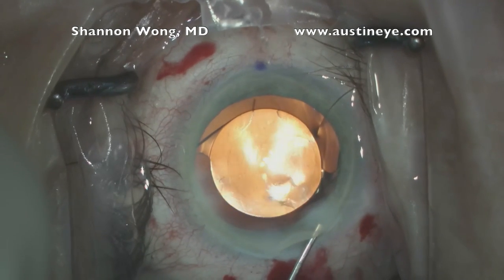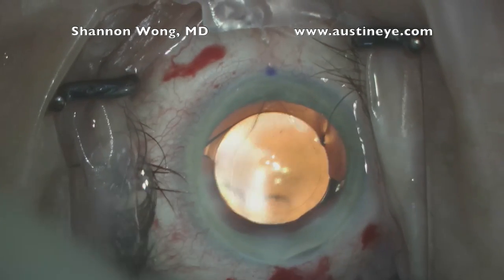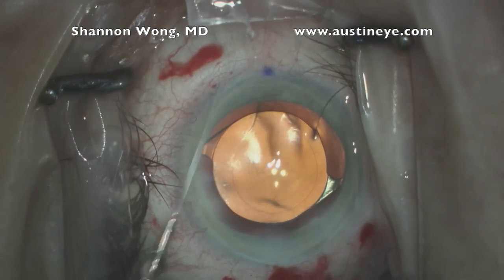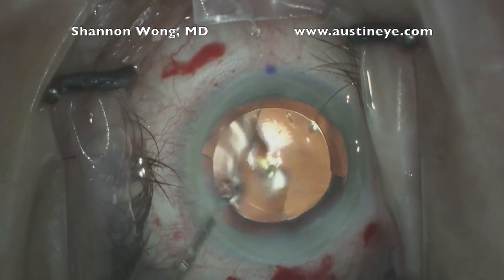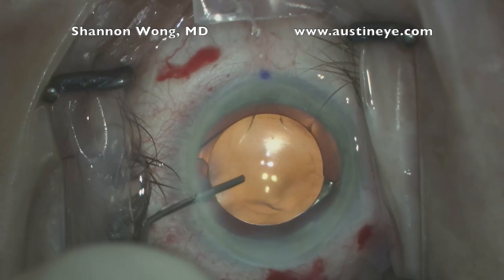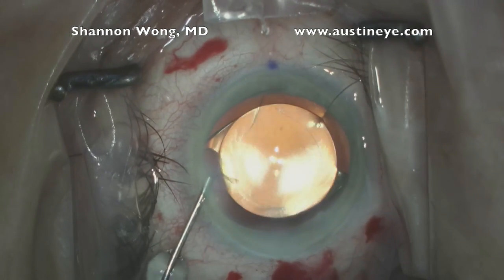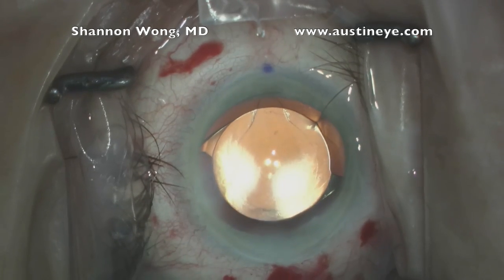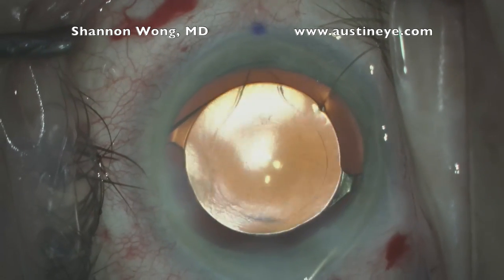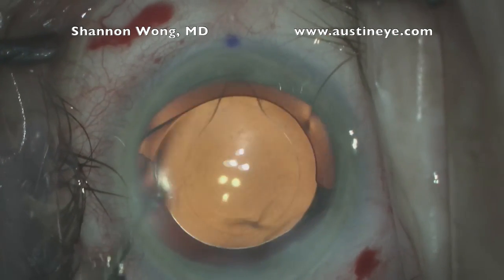At the conclusion of this case all the incisions are self-sealing and this patient did quite well — he was 20/20, J1 Plus, plano the day after cataract surgery. The point of this case is to show that even with the latest generation of femtosecond lasers, as of February 2014, anterior capsule extensions can occur. But as long as early identification and proper management is employed, patients do just fine. The lens was perfectly centered at the conclusion of the case. Thank you very much for your time and attention.